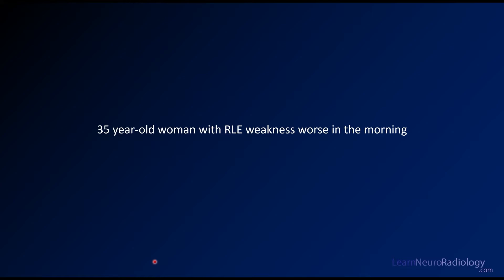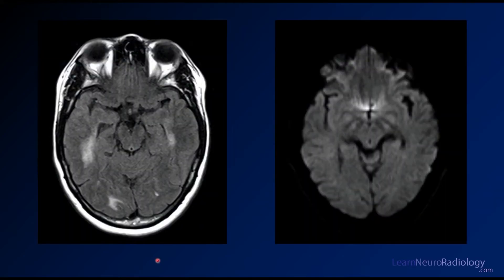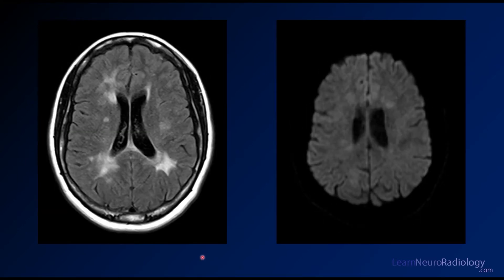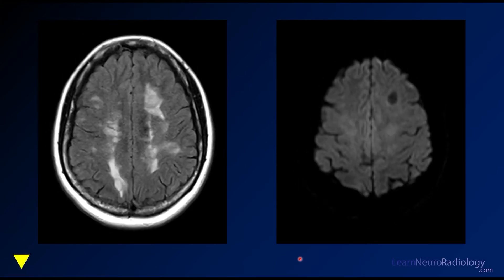The first case is a 35-year-old woman with right lower extremity weakness. You have FLAIR on the left and diffusion on the right. What you're seeing is some periventricular white matter FLAIR abnormalities. It's a little bit faintly bright on DWI, but nothing too much to worry about. If you keep going a little bit higher, you see a little bit more of the same. By now you should really be having some thoughts about what you think this is, especially in the context of this lecture.